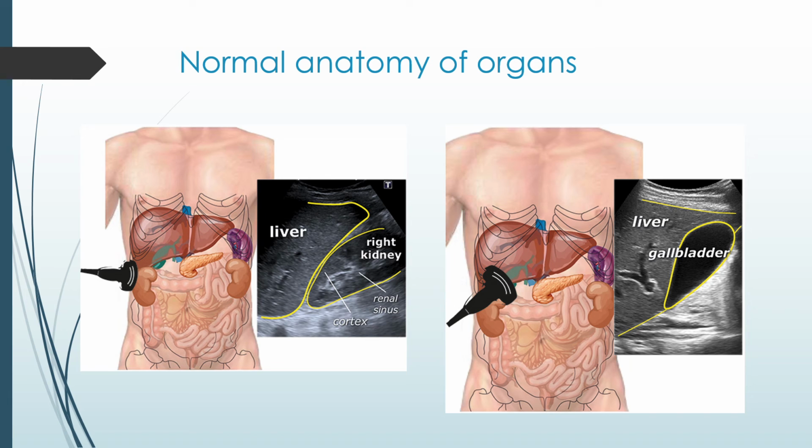On the right side you can see the gallbladder. The gallbladder is best evaluated when the patient is in the fasting state. When the gallbladder is filled with hypoechogenic bile, the gallbladder wall thickness is usually less than 2 millimeters. When the patient inhales deeply, the gallbladder will appear from under the rib cage, and the gallbladder now lies against the abdominal wall, enabling you to use the echo transducer to push into the gallbladder and evaluate its compressibility. A filled gallbladder will be partially compressible when you push against it.